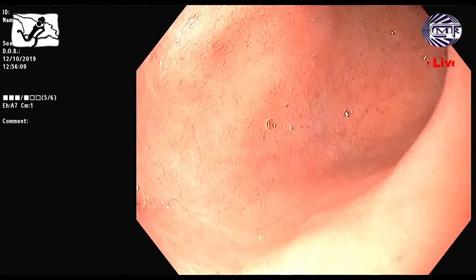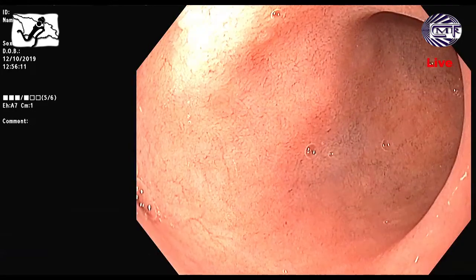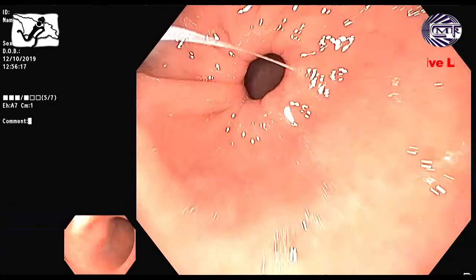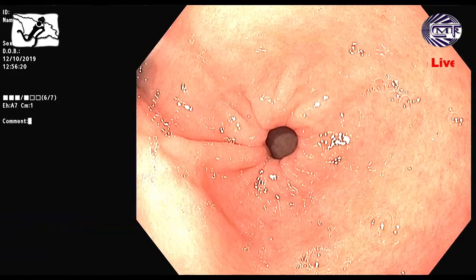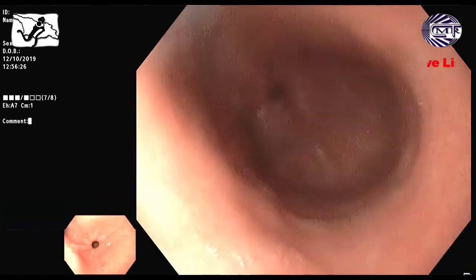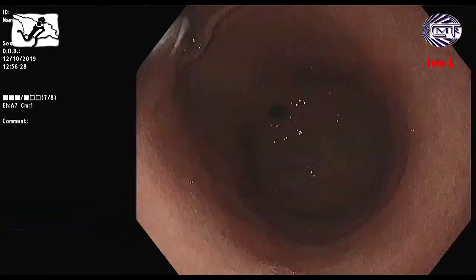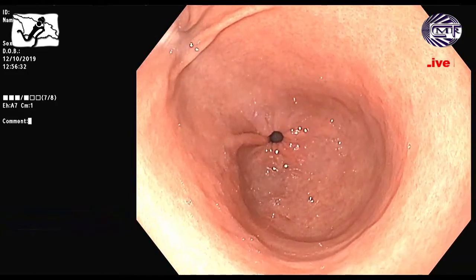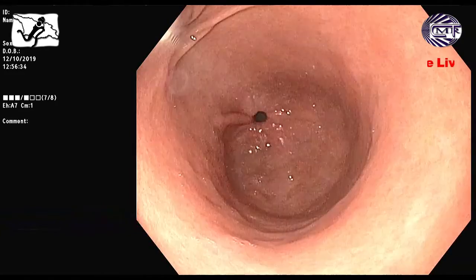This is a normal duodenal bulb, like that. Yeah. See? And pyloric ring. See? And then usually I divide the 4 parts of each stomach. This is antrum, right? Yeah. Just one more. Just a moment.